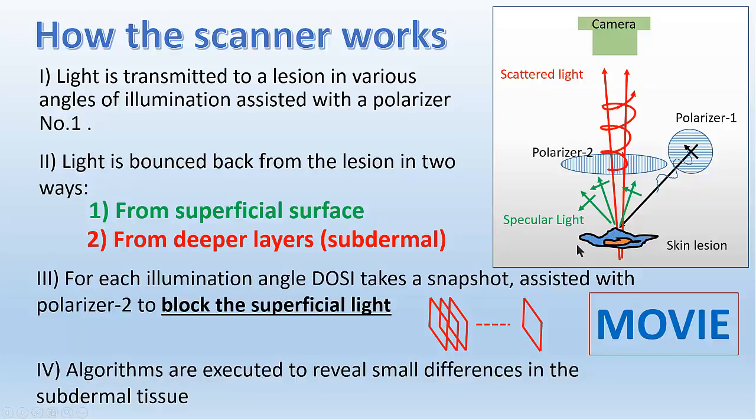Now, a healthy area, which transmits more or less the same light, will appear in black, and a distorted area that behaves differently to a different state of polarization will emerge in grayscale, more white, and by that we can follow the underneath distortion. It's very important to understand what happened underneath the skin much before the pigmentation appears, and sometimes it's too late.